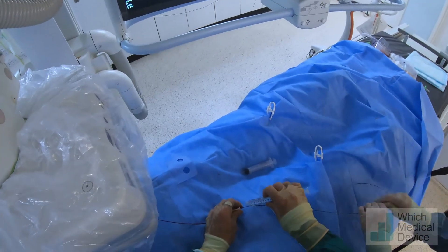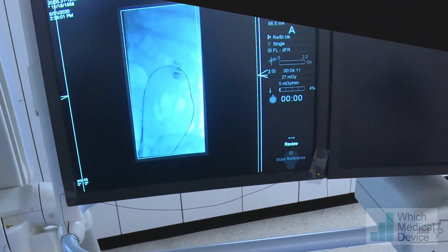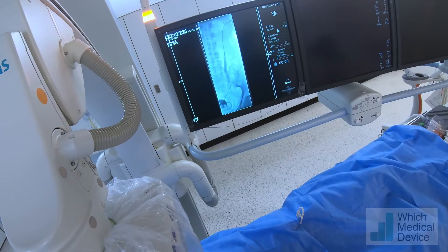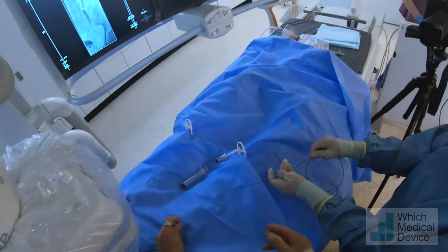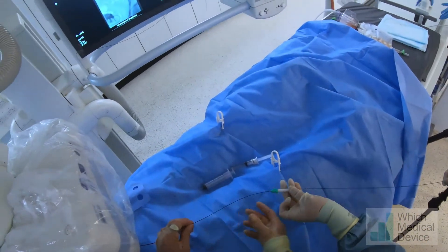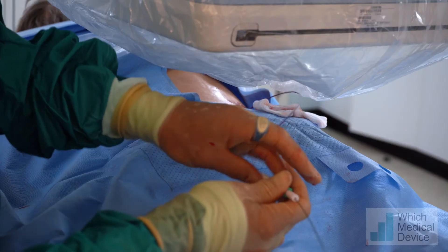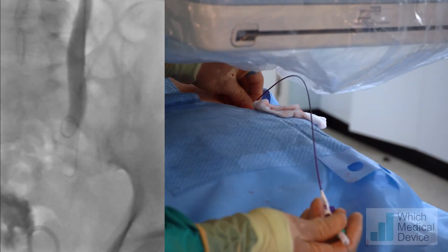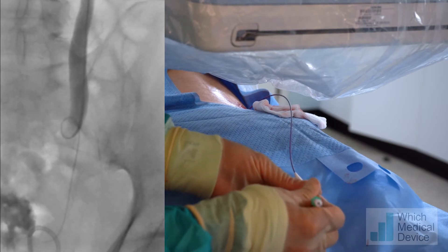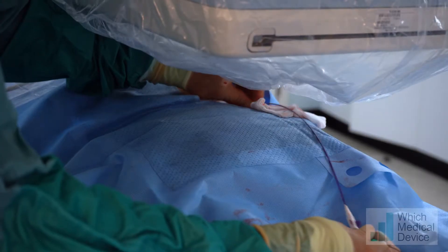We'll confirm we're in the ureter, not just dissected alongside it — it did go very, very easily, and we've got urine coming back. We're following that dilated ureter down. There's a bit of dilated, tortuous ureter — the ureter often forms loops when it's very dilated. Taking more wire down around that loop, and it's gone straight into the bladder, no problem. Pushing more wire in and it's straightened out now, so we're just going to take the catheter down.